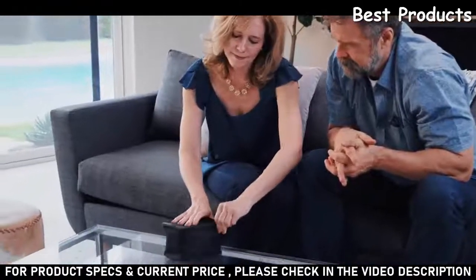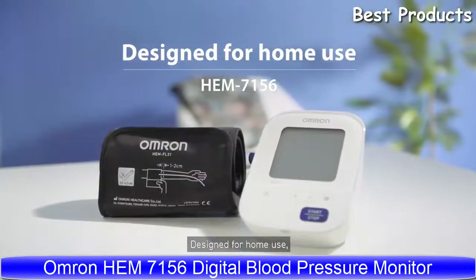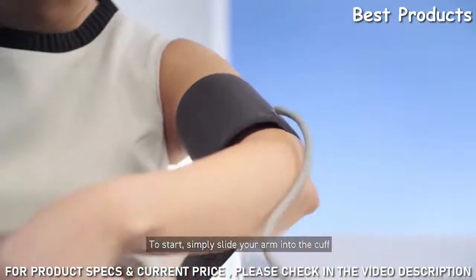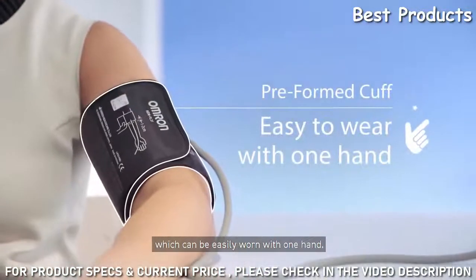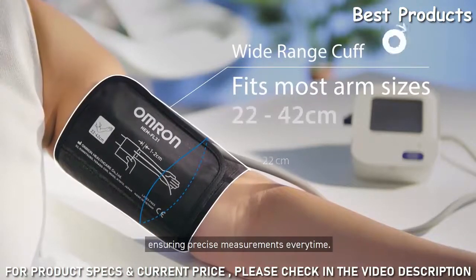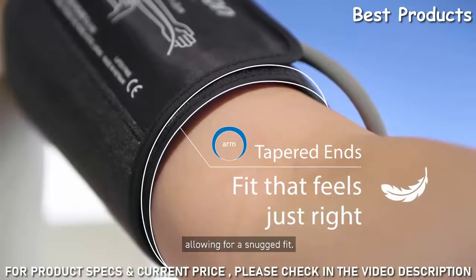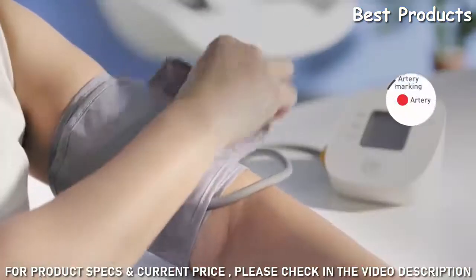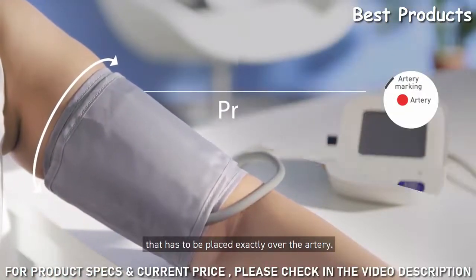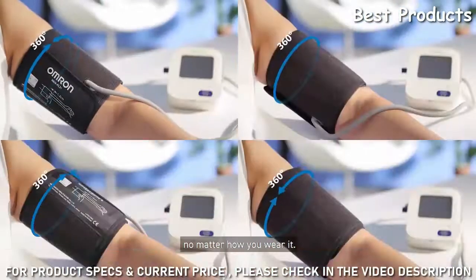The EBP UA5 has everything you need to accurately and safely monitor your blood pressure. Designed for home use, featuring the Intelli-wrapped cuff suitable for first-time users — simply slide your arm into the cuff, which can be easily worn with one hand. The wide-range cuff is designed to suit most Asian arm sizes, ensuring precise measurements every time. The tapered end design allows the cuff to be close-fitting for a snug fit. A regular cuff has a limited accuracy zone that must be placed exactly over the artery, but the Intelli-wrapped cuff has a 360-degree accuracy zone that ensures an accurate reading no matter how you wear it.